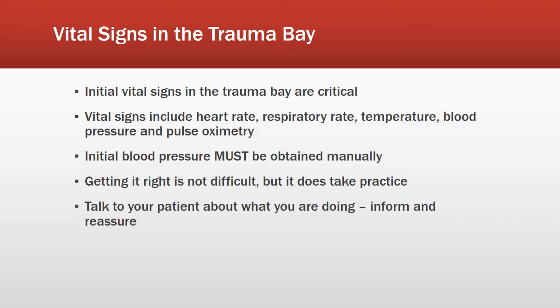In the Trauma Bay, the initial blood pressure must be obtained manually, so we're going to learn how to do that. Getting it right is not difficult, but it does take a little bit of practice. One thing I want you to remember is that you need to always talk to your patient throughout these procedures. Inform them what you're doing, why you're doing it, and reassure them throughout the procedure.